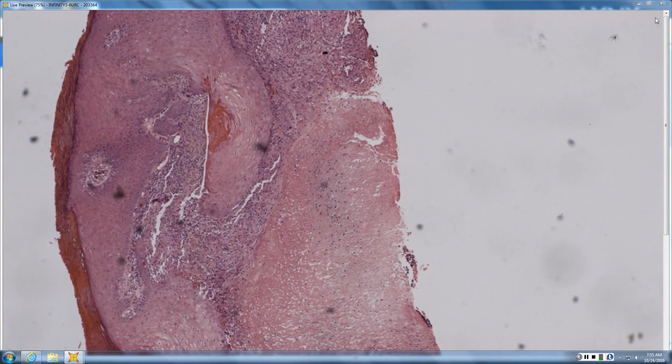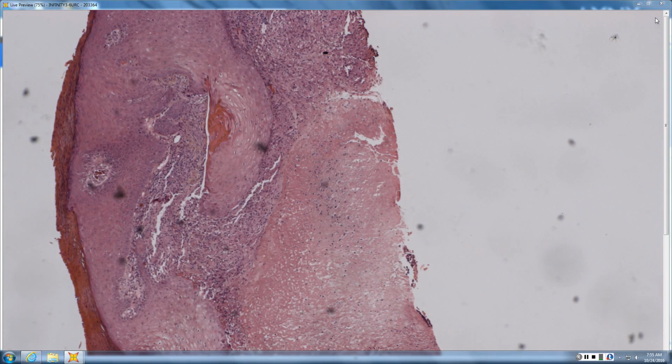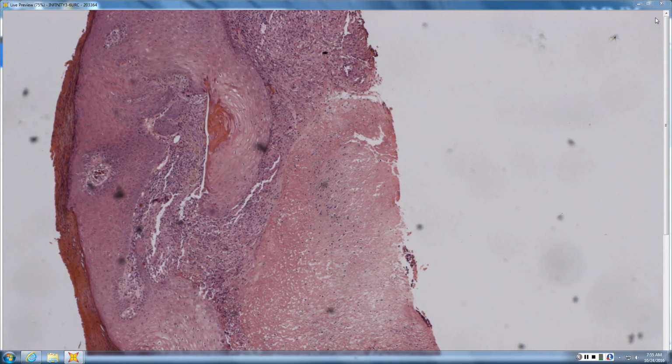So something infectious, with TB being at the top, your classic caseating granulomatous disease is tuberculosis. And then LMDF, lupus miliaris disseminatus faciei, or you can say acne agminata because it's a little easier, is a form of caseating rosacea where you have very discrete papules all over the face, and histologically they look just like miliary tuberculosis.